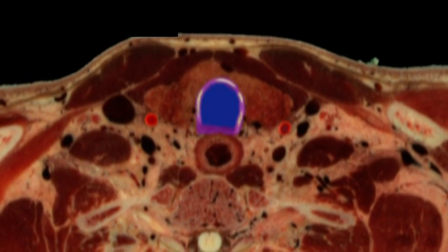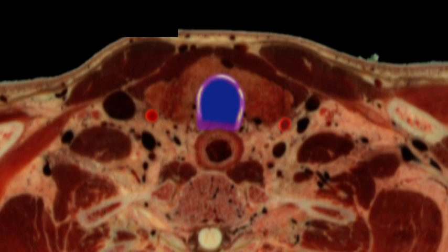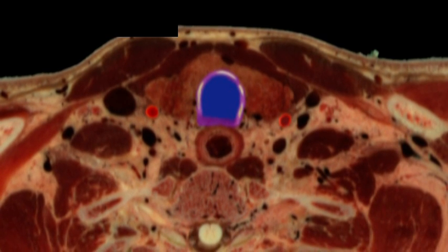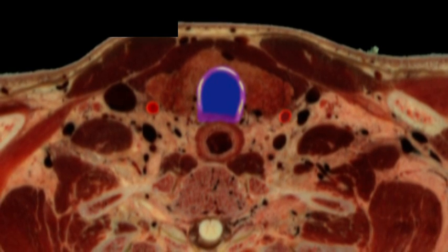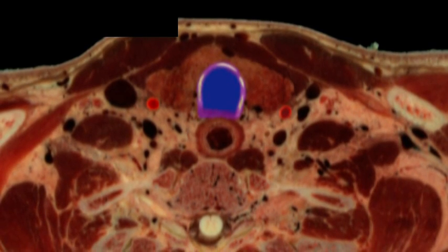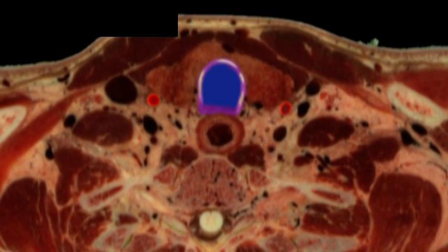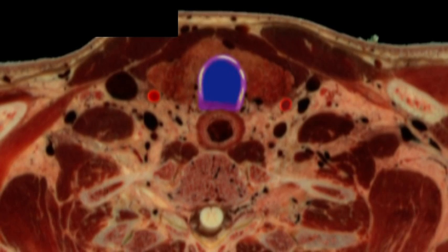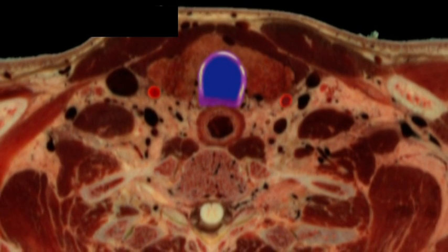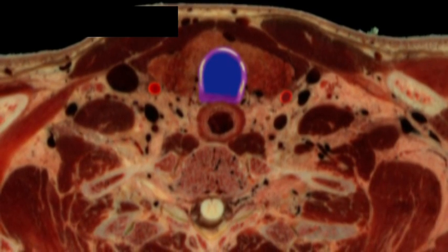Look carefully at these images from the thyroid gland in the VH Dissector cadaver. Notice that the right lobe is inhomogeneous compared to the left.